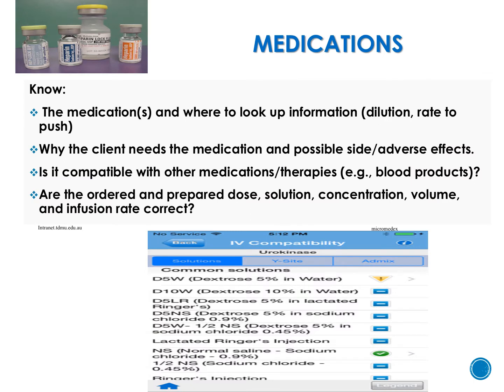When giving a medication IV push, there are some things that you need to know that you might not need to know if you're giving a medication by mouth, for instance. We need to always look up the medications, and when you look the medication up, of course, we're looking for potential adverse reactions that might happen, but you also want to look up if the medication needs to be diluted, and if so, with what, normal saline or sterile water. You also want to know what the rate of the push is, so how fast you can push it.